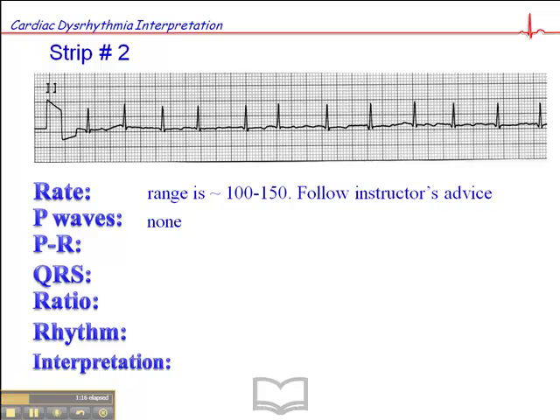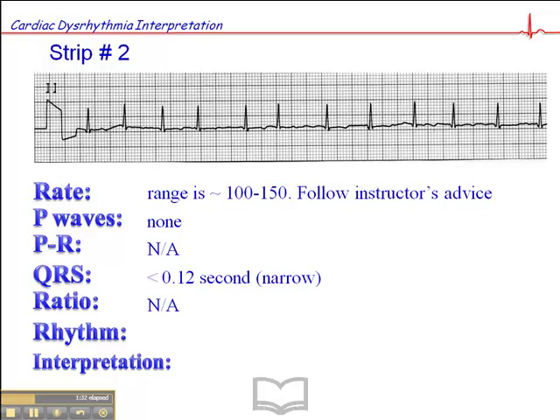P waves are not discernible here whatsoever. There are some bumps along the way, but there are no clearly discernible P waves and no consistency whatsoever. If there are no P waves, there's no PR interval. The QRS is narrow — less than 0.12 seconds. That's the key. And the ratio, if there are no P waves, is really not applicable.